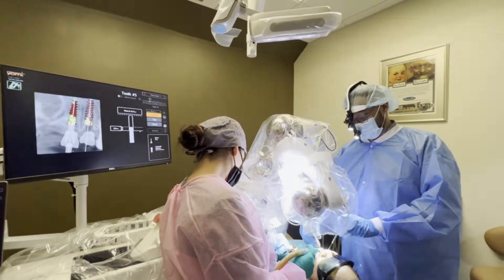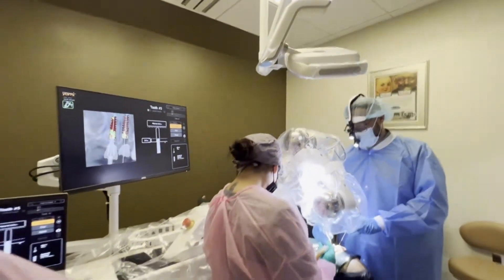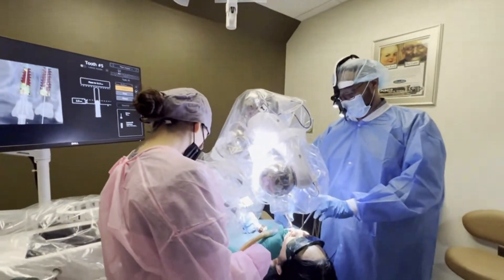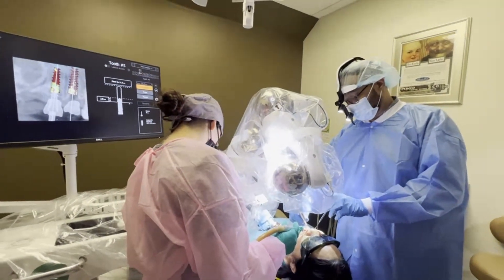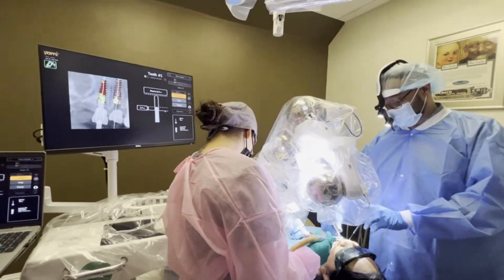Alright. So the robot has locked in the position and I'm confirming it myself, making sure it's at the right spot.